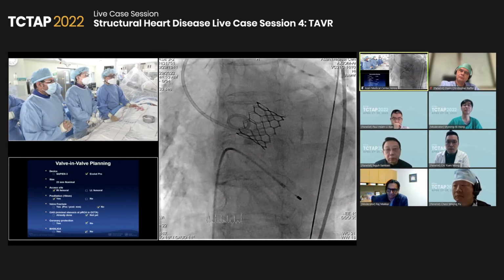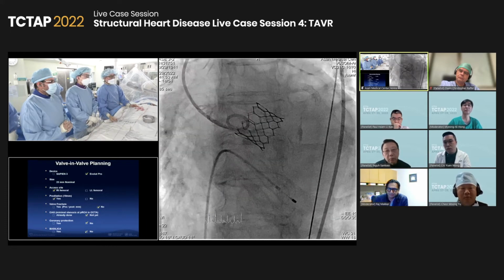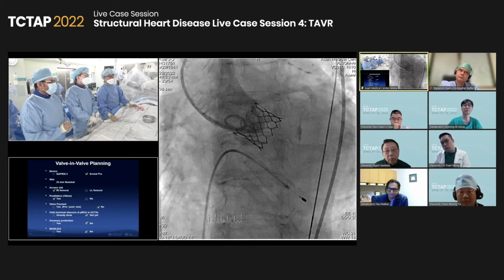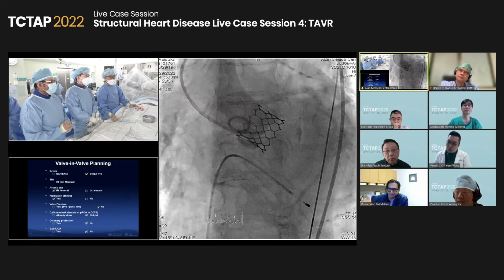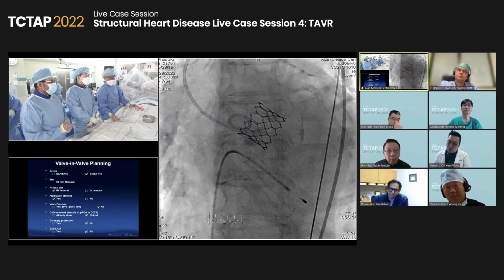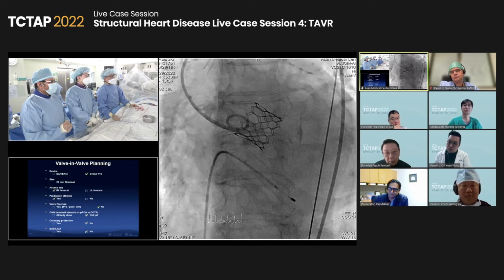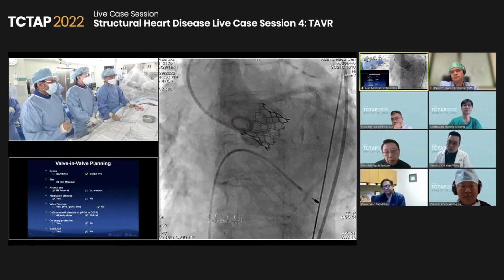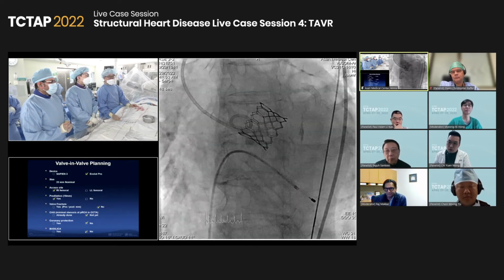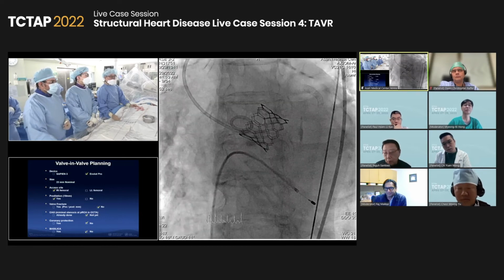To summarize this patient, an 82-year-old female, we implanted a Sapien 3 23 five years ago, in 2017. The patient did well for 3 years, but nearly 7 months ago, the patient complained of new-onset dyspnea. Over the last 6 months, the Vmax and the mean pressure gradient by echocardiography have been going up. In our heart team, we discussed 2 or 3 times how to treat this patient.